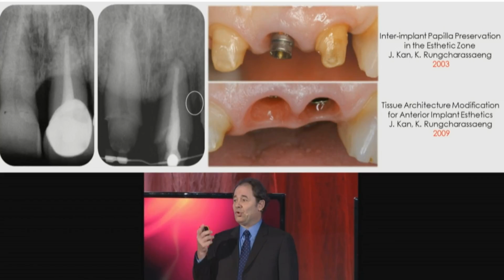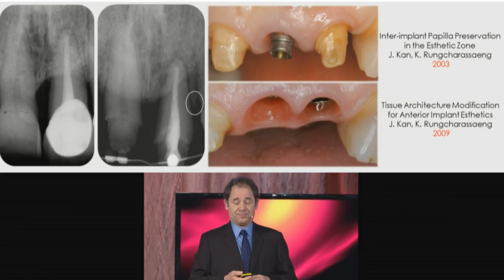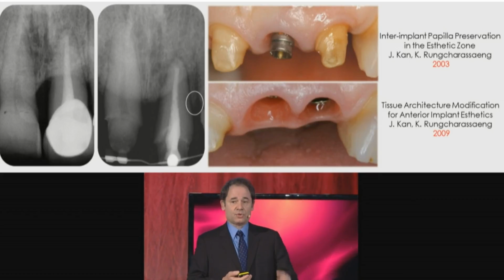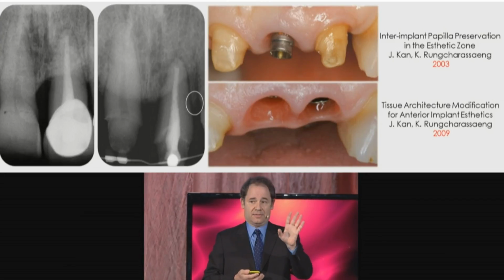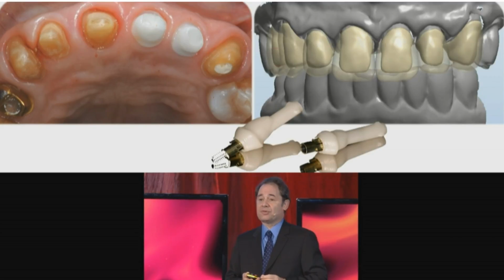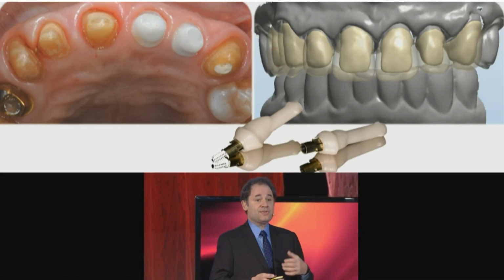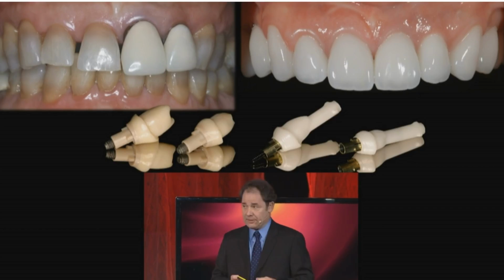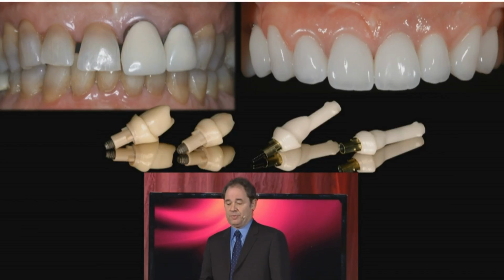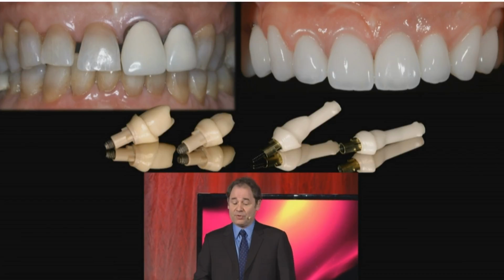From there, the Loma Linda group, led by Joseph Kan, gave us a system which is the sequential extraction system. What they recommended is you extract and place an immediate implant for one central incisor. So we place the Replace Select here. Wait about 6 months, so your temporary is supporting the interdental papilla, and then extract the other incisor and place the next immediate temporary. With that system, they reported reasonably good maintenance of the interdental papilla height. Now, this is a treatment that will take time. It is not for every patient because it's a lot of interdisciplinary treatment. You have to have good patient selection and a good patient mindset for this type of sequence.